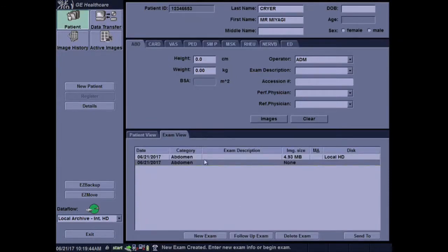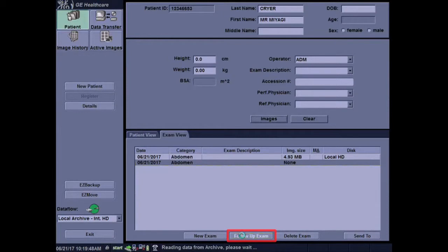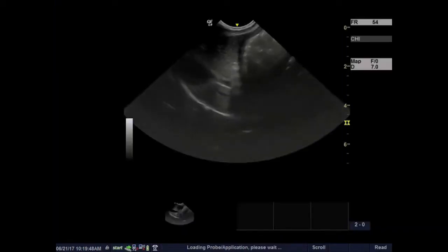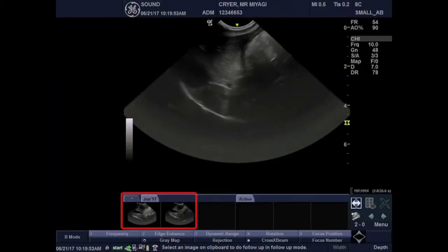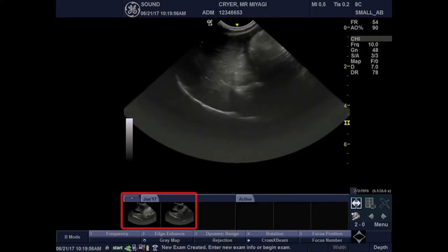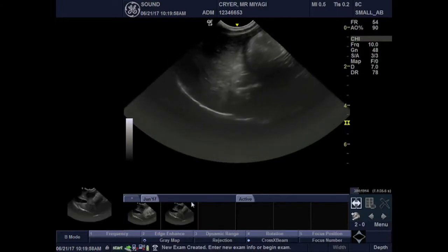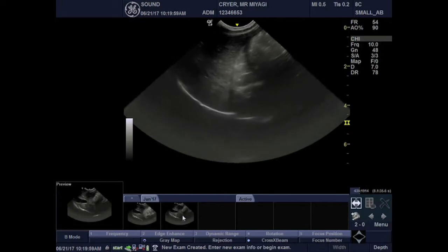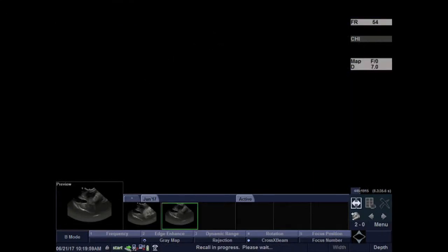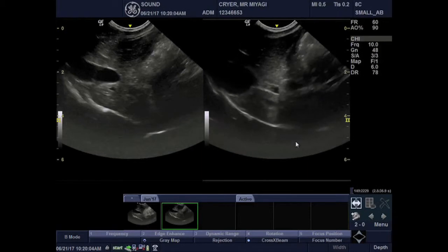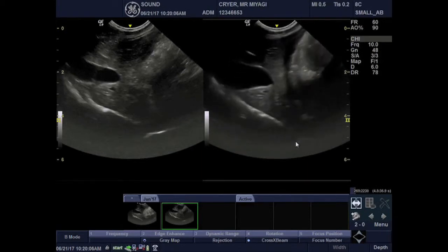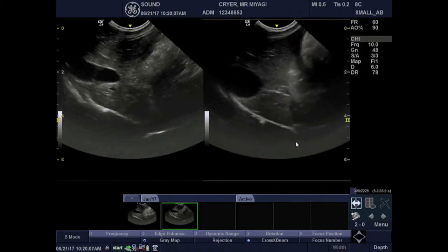Once we have the new exam opened, we will open the follow-up tool and the archived images will be on the left of the screen at the bottom. We'll select the image we want to compare from the previous study, and that will now be on the split screen to the left while the live imaging is on the right.